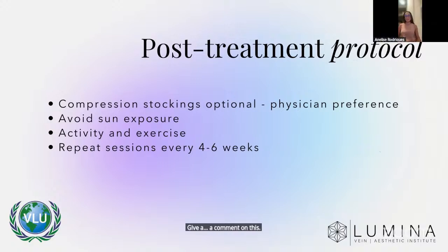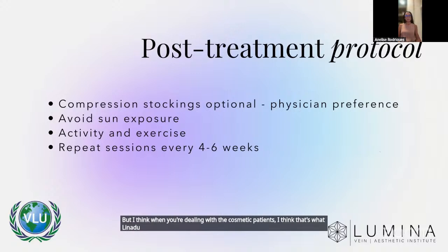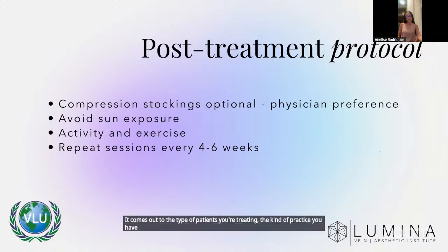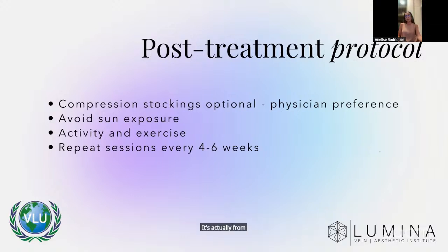I think this is the main question when we talk about CLACS. But when you're dealing with cosmetic patients, which is mostly what Lina does, the small amount of time you save for this kind of patient might make a difference. So it comes down to the type of patients you're treating and the kind of practice you have, because CLACS is for private practice by all means.